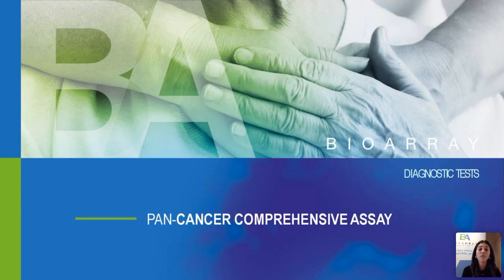The main difference between this one and the previous one, as you will see in a minute, is that this one is a little bit smaller in the number of genes that we check. And also, we do not include the tumor mutation burden and the microsatellite instability assessment.